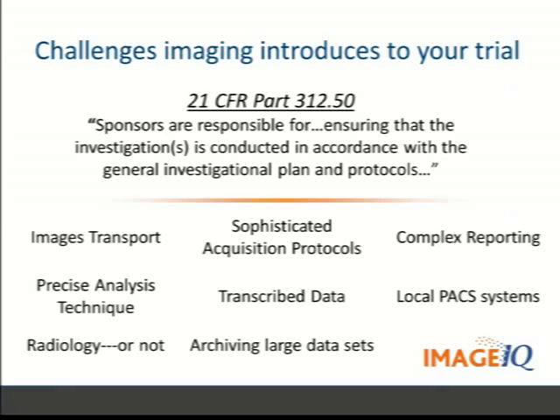The first thing you've got to do is move these images around. While we're all used to tweeting and Snapchatting or whatever, moving medical images is a little different, right? And moving large image sets is very different. So you've got to deal with that.